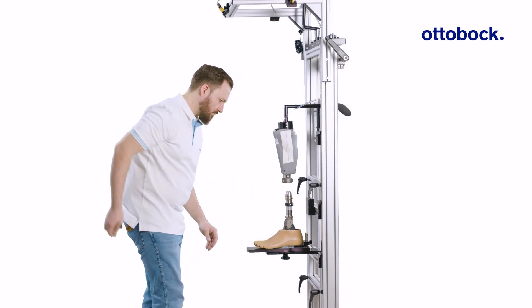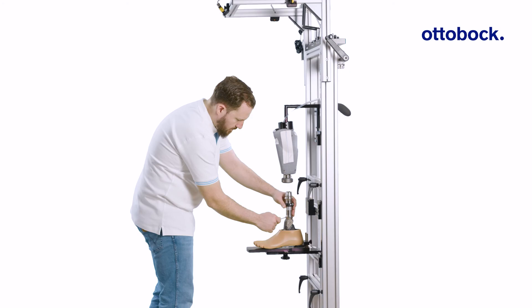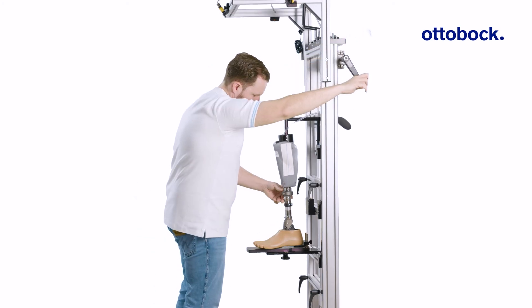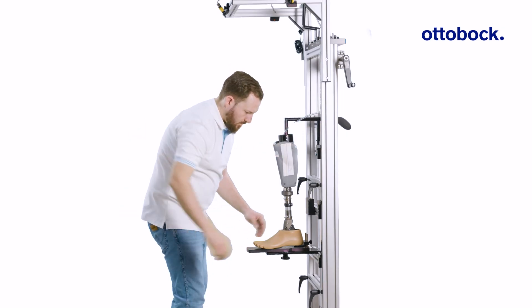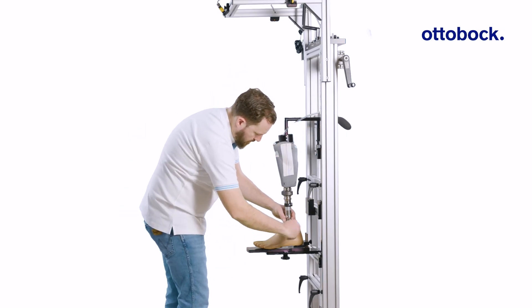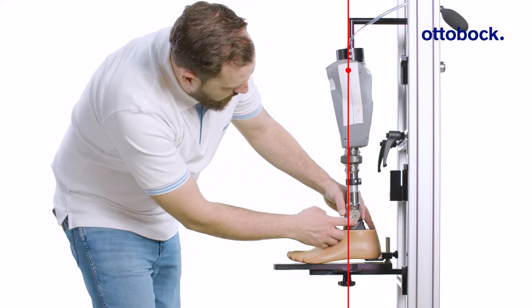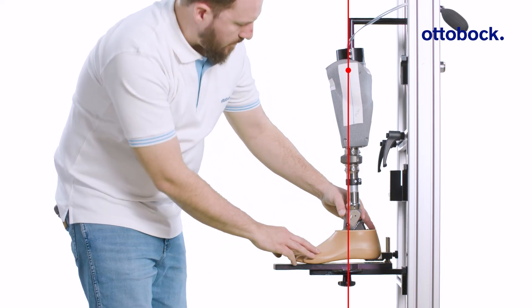In this example, the socket was pre-configured with the new Ottobock quick-change adapter. After connecting the components, check the correct orientation of foot and socket again.